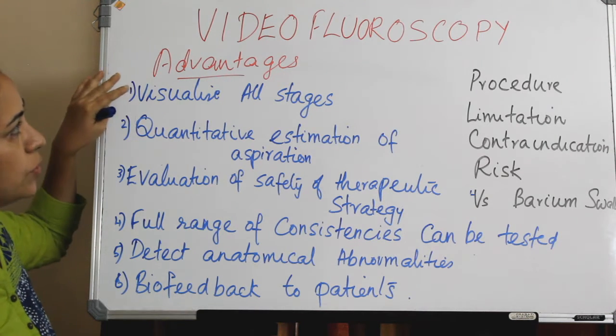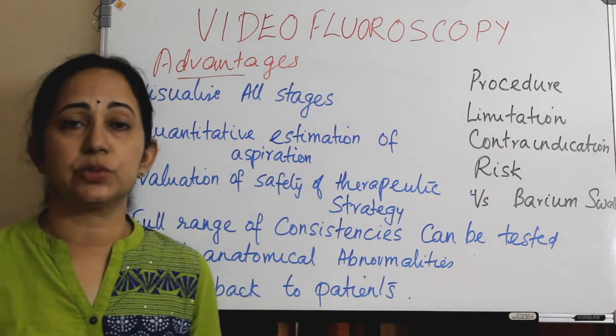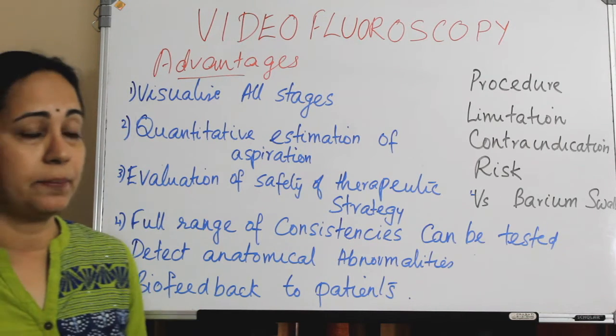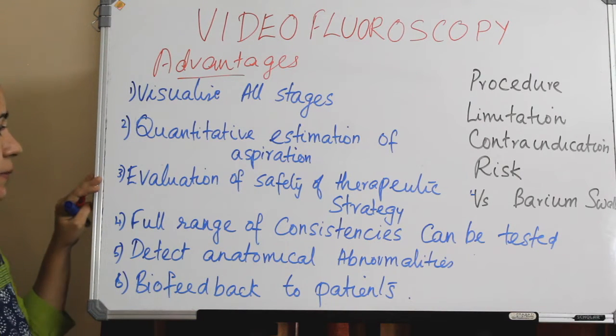The advantage of videofluoroscopy is that we can visualize all stages of swallowing, and we can get a quantitative estimation of aspiration, which was a major disadvantage of FEES. Here we can get a quantity: how much penetration is there and how much aspiration is there can be clearly estimated.